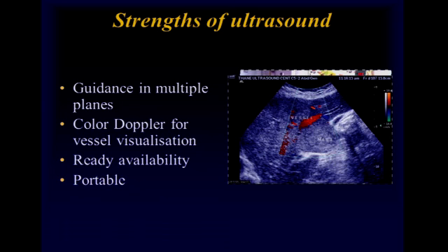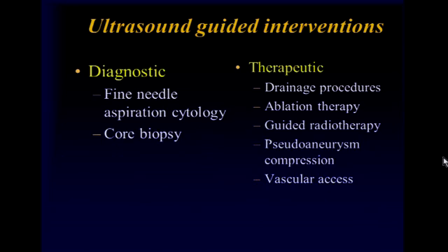Besides this, ultrasound has several strengths. One can guide in multiple planes. One can switch on color Doppler and have a look at the vessels around. It's readily available, and one can do procedures with a portable machine in the ICU as well.